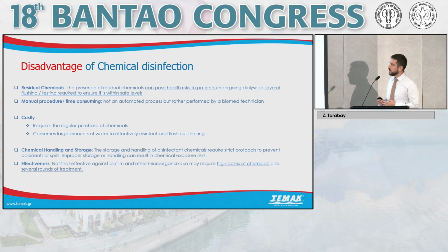It requires the regular purchase of chemicals. It consumes large amounts of water for effectively disinfecting and flushing out of the ring. Of course, you have all the difficulties to store and handle the chemicals. And finally, it's been shown that, okay, it may be effective, but sometimes you may require very high concentrations of the chemicals. And also against biofilm, it has been shown to not be as effective as hot water, which we'll see a bit later on.